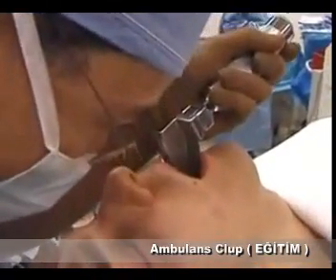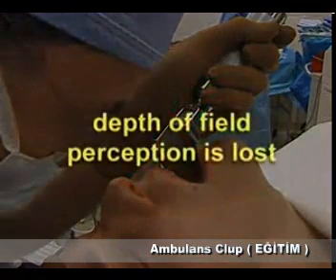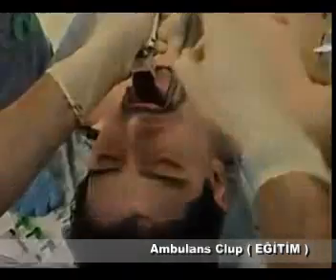Lastly, do not get so close to the oral cavity that you lose stereoscopic vision with both eyes. If you get too close, depth of field perception is lost and recognizing the anatomy and placing the endotracheal tube may be more difficult. Furthermore, if the patient coughs, more secretions will reach your face.